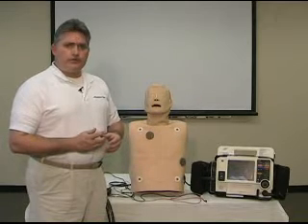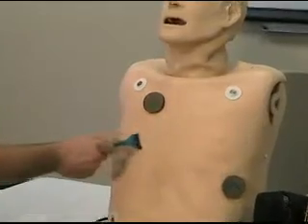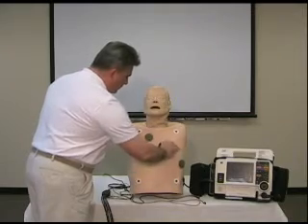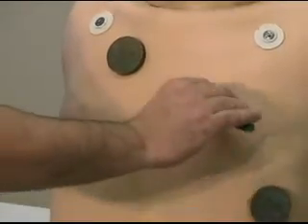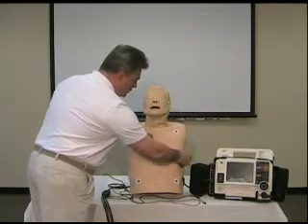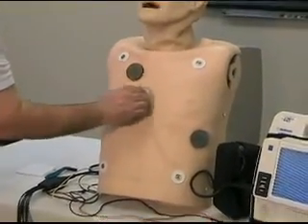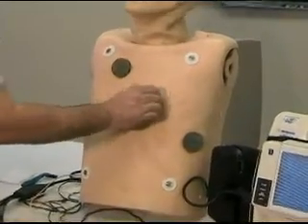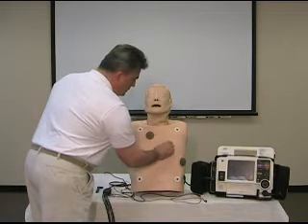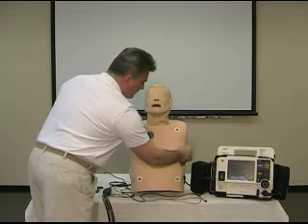There's some important things that you need to do before you apply the electrodes, and that's prepping the skin. First, remove any excess hair where the electrodes will be placed. Razor or clippers will work just fine. The purpose is to get the skin as smooth as possible so that the gel from the electrodes will adhere closely to the skin. Next, prep the skin by using a 4x4 and briskly rubbing the skin where the electrode will be placed.